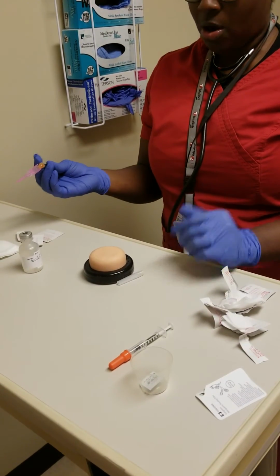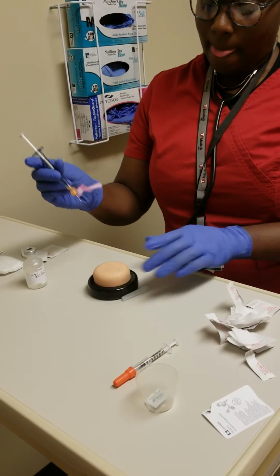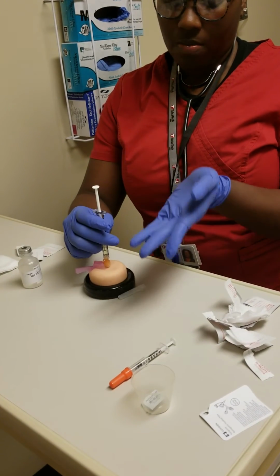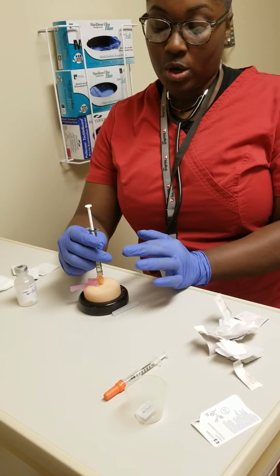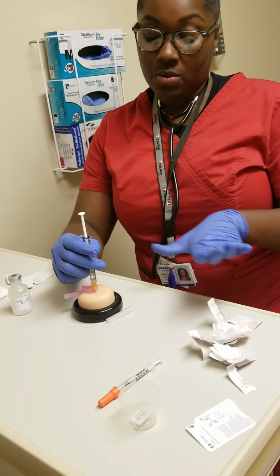If this patient was a larger patient, then I would use maybe a 1-inch needle. So that same area, I will go in just like that, inject my medicine. I will take about 2 to 3 seconds to inject, but you don't want to rush the medication in, because you want it to have time to absorb in the muscle.